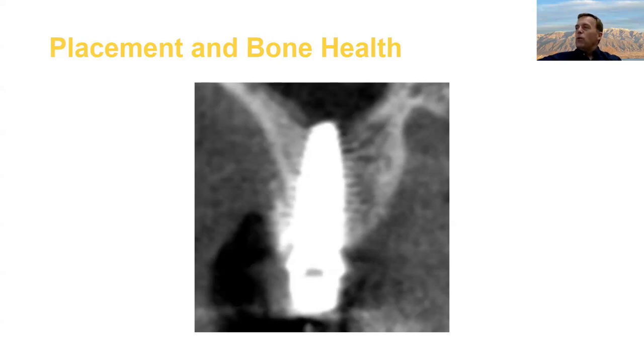If your implant is so large that we're not having enough bone around there to really give us good blood perfusion, then we probably should go a little bit smaller. We'll talk about the drivers for larger implants on another slide, but as in most things in dentistry, there's a tension, and we kind of want to exist in that happy spot in between.